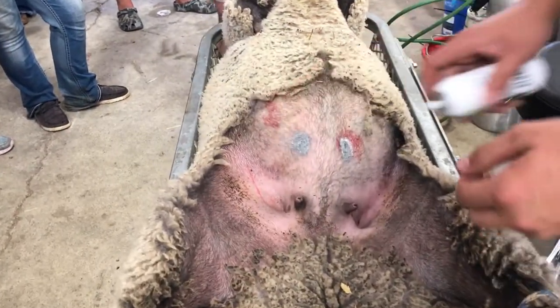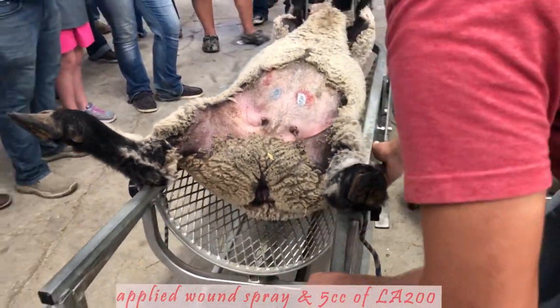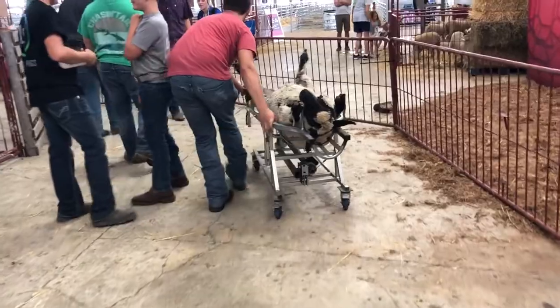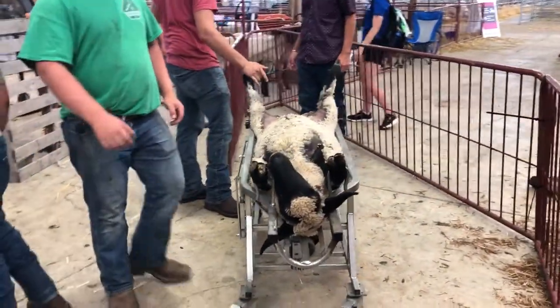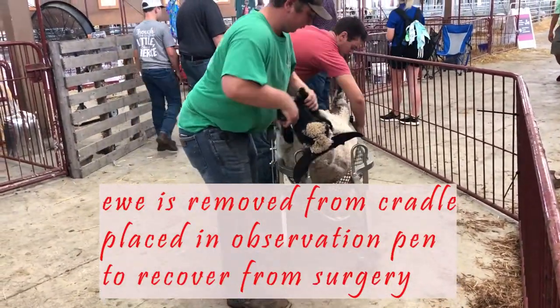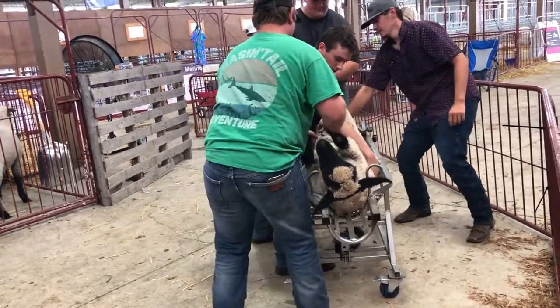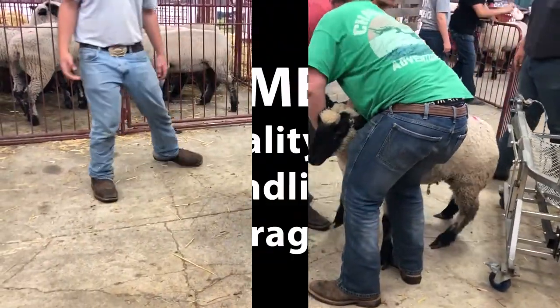Remember at the conclusion of the surgery, we did apply a wound spray here to the two incision sites. The ewes were slightly sedated, and as we move them back to a recovery pen, we'll probably want to observe them for about a half hour or so. This specific group of ewes will then travel 40 miles back to the producer's home, and that probably really doesn't cause any problems because there hasn't been any attachment in the uterus yet.